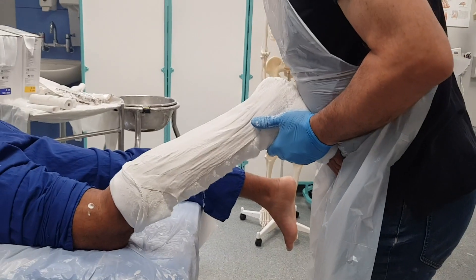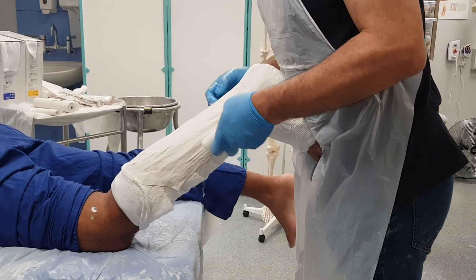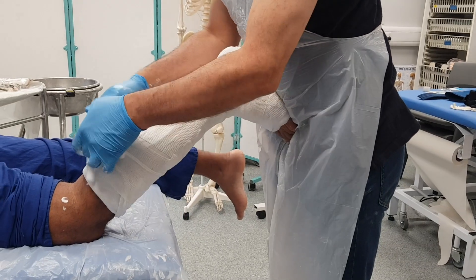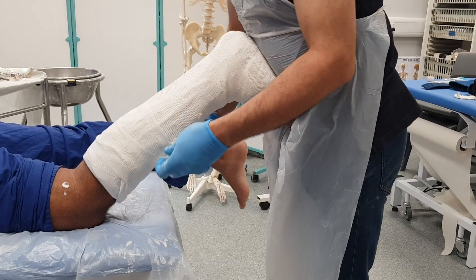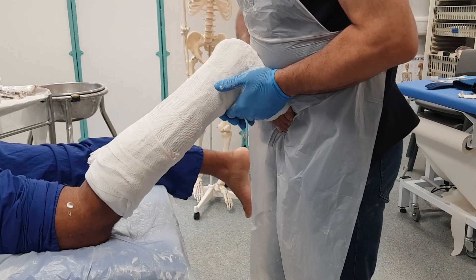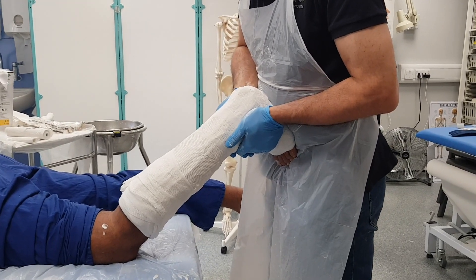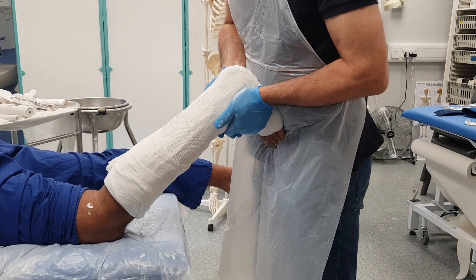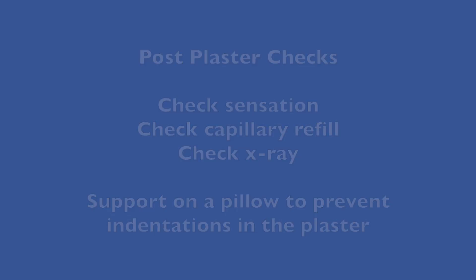I can then bend the knee so that the gastrocnemius is relaxed, and I'm using my abdomen to control the ankle so it's at 90 degrees. Because these are generally external rotation injuries, I'm going to use the position to slightly internally rotate the ankle — holding the malleoli and internally rotating the ankle. This should help keep it in a position of reduction. After your plaster has been applied you need to perform routine checks including a check X-ray to make sure the position is satisfactory.